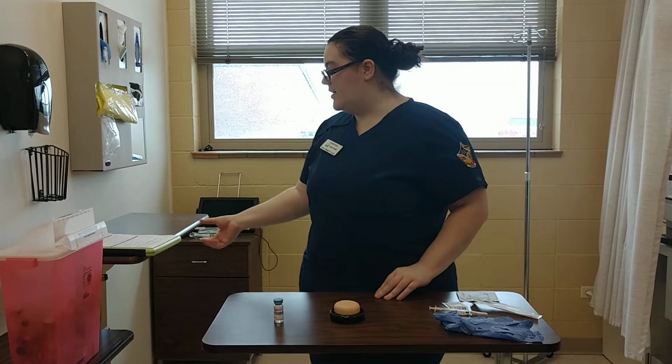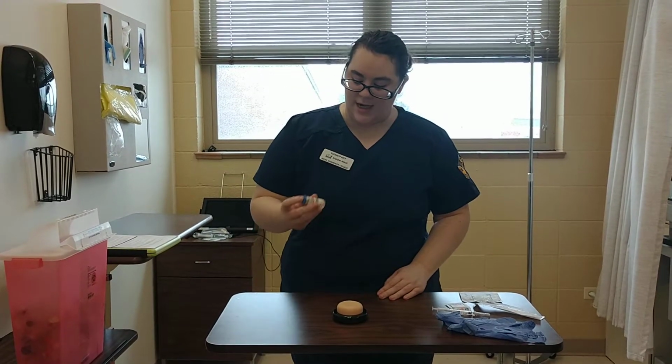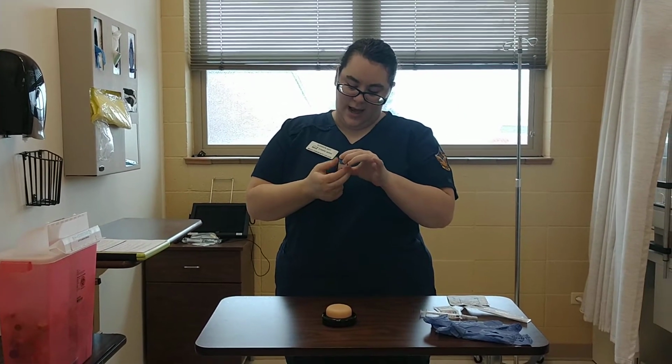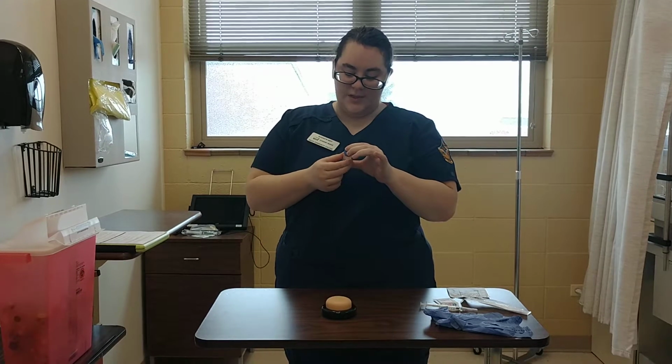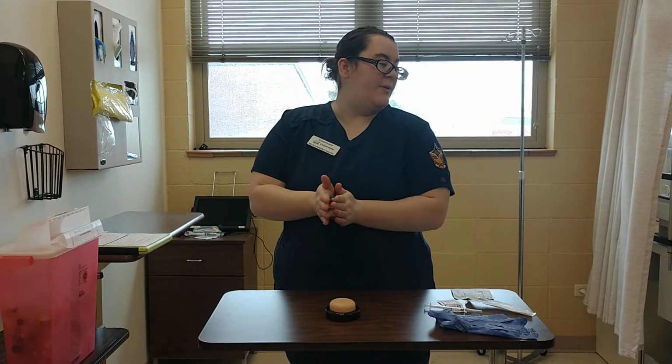I'm going to check the doctor's orders and the MAR, and I'm going to get my medication. I'm going to check my medication for any cracks, particulates, and the expiration date. If it's a multi-use vial, I'm going to make sure it's properly labeled with the time, date, and the initials. And I'm going to mix the medication by rolling it in between my 2 hands.